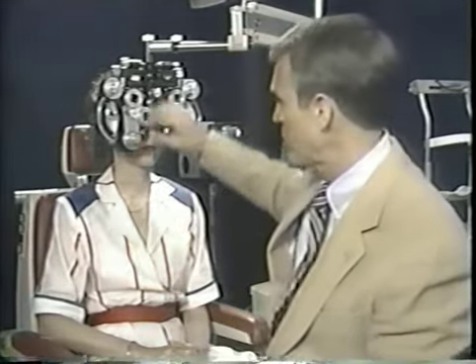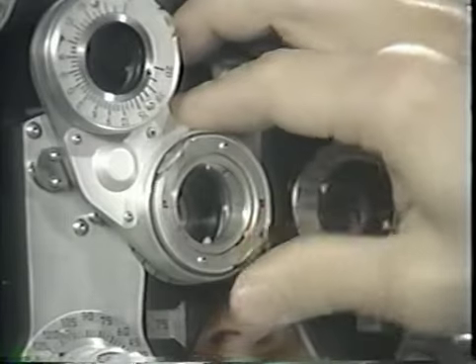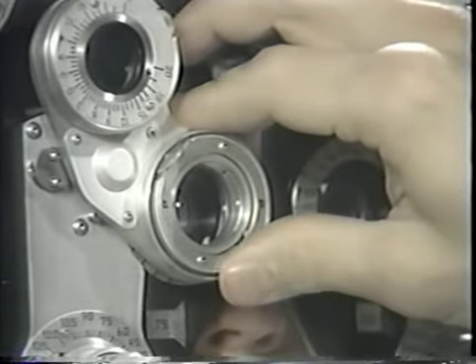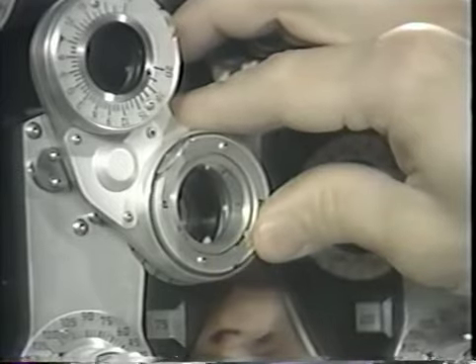To avoid confusion in cross-cylinder testing, it's best to use numbers such as 3 or 4, 5 or 6, instead of always asking which is better, 1 or 2. It's also best to give 2 fresh choices each time, such as which is better, flip 1 or flip 2, rather than asking which is better, 1 or flip 2. Each flip is helpful in catching the patient's attention and in speeding up the process.